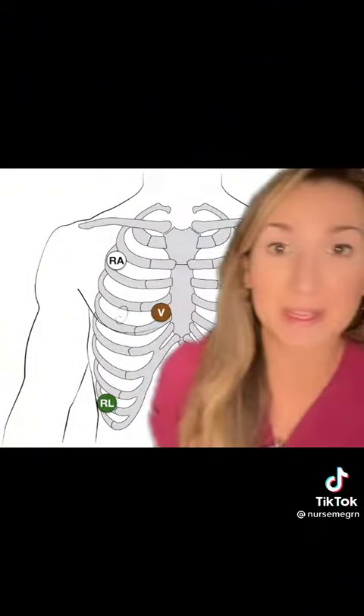Do you know how to put a patient on a cardiac monitor? Do you know where all the leads go? Super easy, let me show you. Here's a picture for your reference, but this is how I remember.